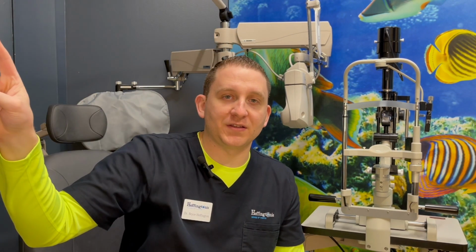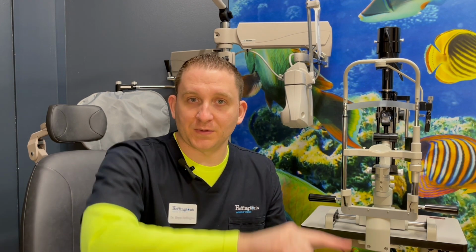And it helps us to look at the peripheral retina, which actually goes beyond the extent of the fundus photos you currently see before you, which is important because we like to look for things out there, whether it's blood or retinal detachments or other conditions that may be causing visual disturbances in the far reaches of your peripheral retina. It's extremely important to have this checked by an eye care professional.